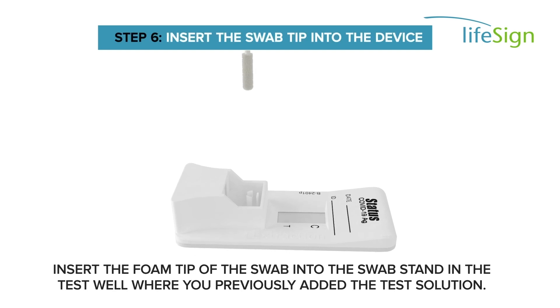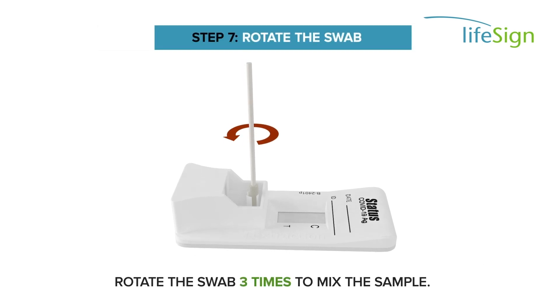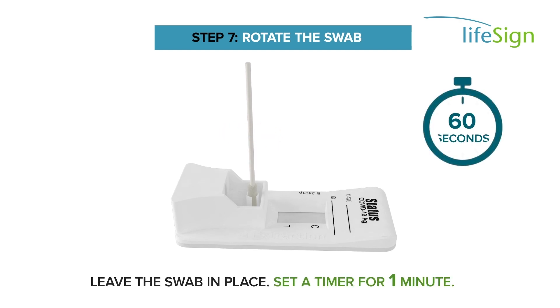Insert the foam tip of the swab into the swab stand in the test well where you have previously added the test solution. Rotate the swab three times to mix the sample. Leave the swab in place. Set a timer for one minute.